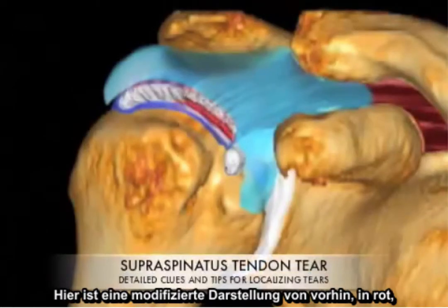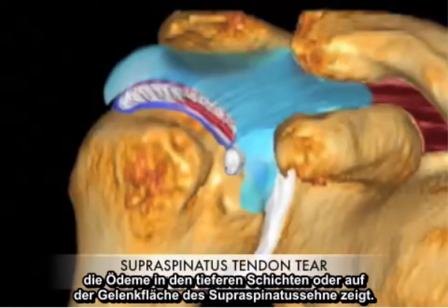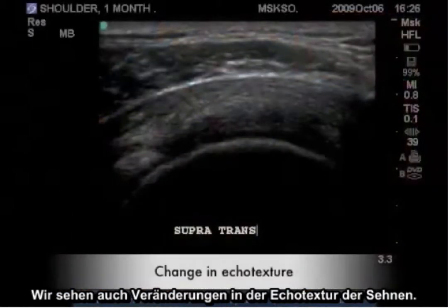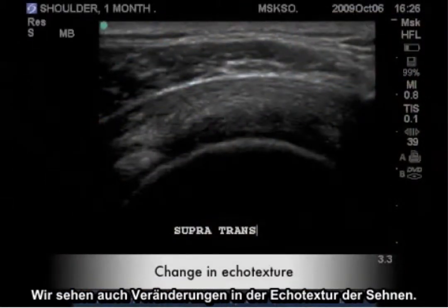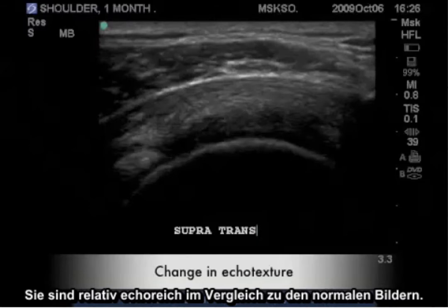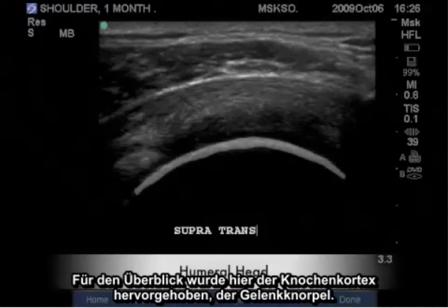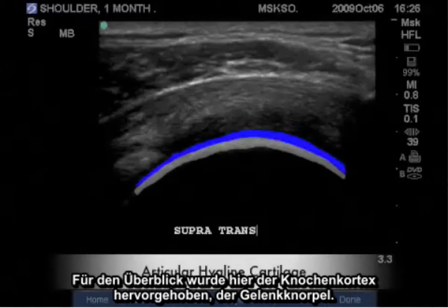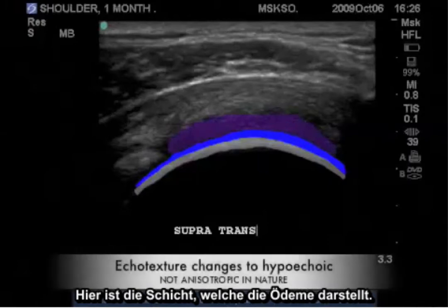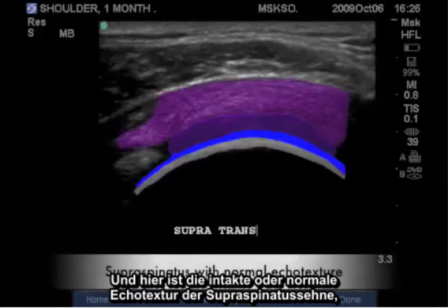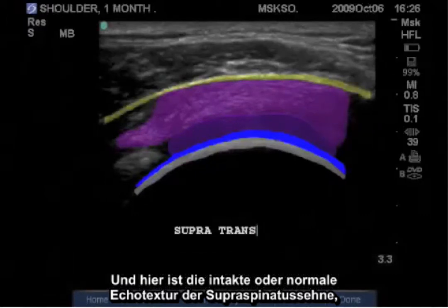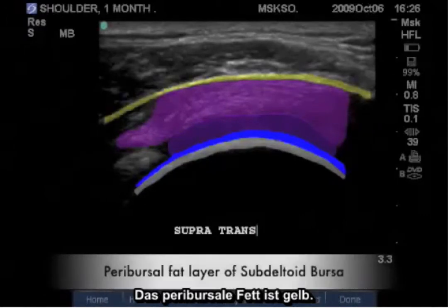Here is a modified illustration showing in red representing edema within the deeper layers or articular surface of the supraspinatus tendon. We also see these changes in the tendon's echo texture — they become relatively hypoechoic compared to our normal images. Highlighted here is the bony cortex and the articular cartilage. Here is the layer that represents edema, and here would be the intact or normal echo texture of the supraspinatus tendon. Yellow would be the peribursal fat.